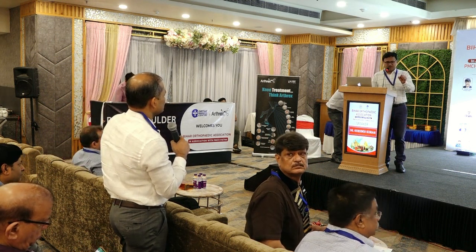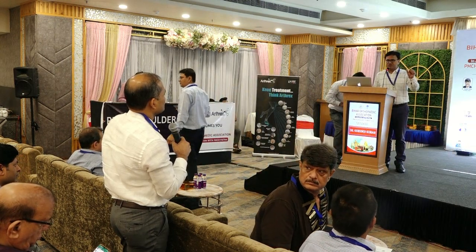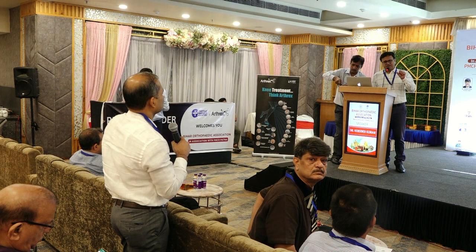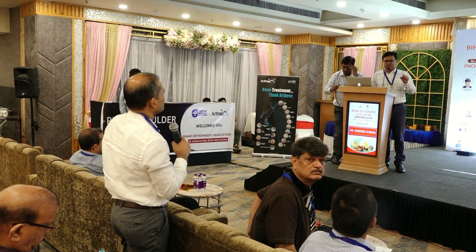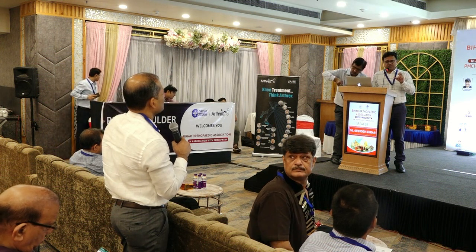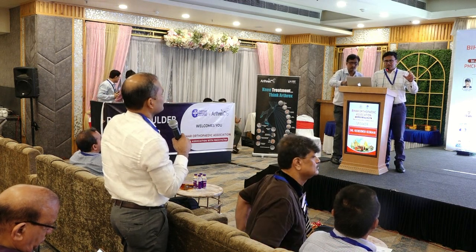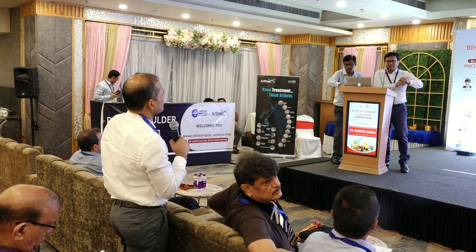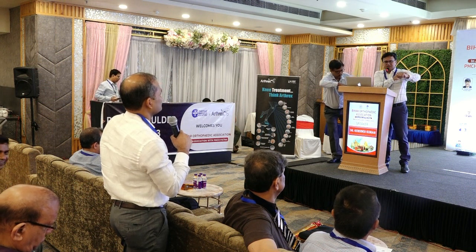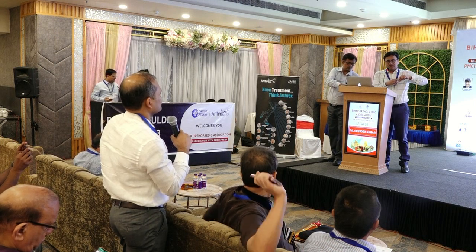Then with your thumb, 2 centimeter inferior and 1 centimeter medial from the posterolateral edge of the acromion, press your thumb, there is a depression or soft spot between the infraspinatus and the teres minor or sometimes in the infraspinatus. Feel the soft spot, then make a small skin incision and introduce your trocar and sheath pointing towards the coracoid process, and ask your assistant to abduct, distract and pull the shoulder up so that you get the space between the moving humeral head and the fixed glenoid, and then you introduce your sheath.